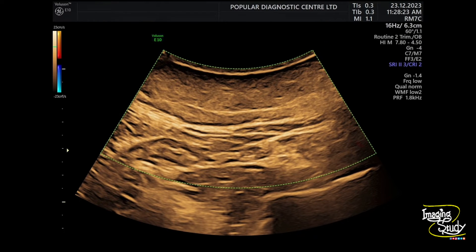Here we have used the curvilinear transducer to see the lipoma. We have used color Doppler also, but there is no apparent internal vascularity. There is also no prominent peripheral vascularity. No intrathoracic communication is seen.